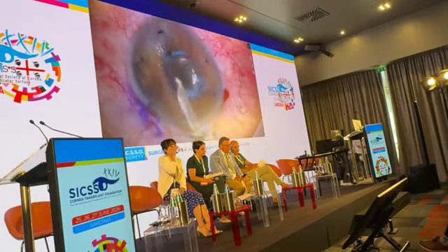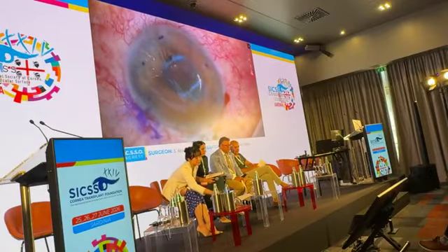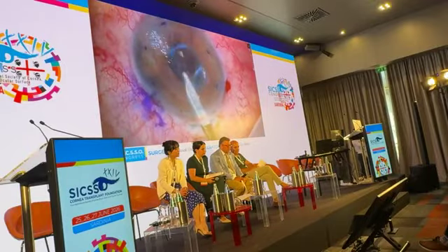And then under Healon GV, he performed the scoring of the Descemet membrane. Healon Pro, sorry, he used Healon Pro. And he performed the Descemetorhexis and removed the Descemet membrane.